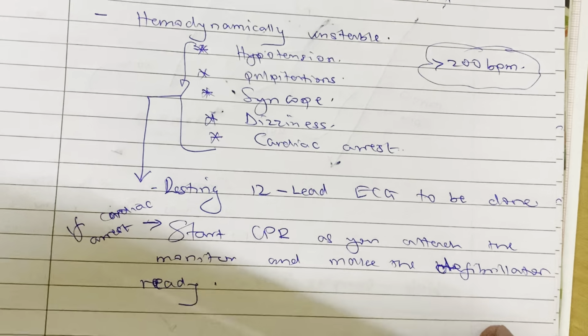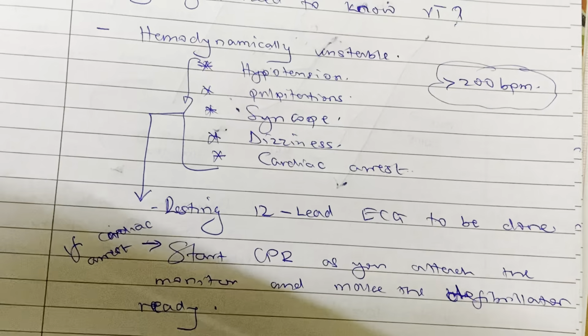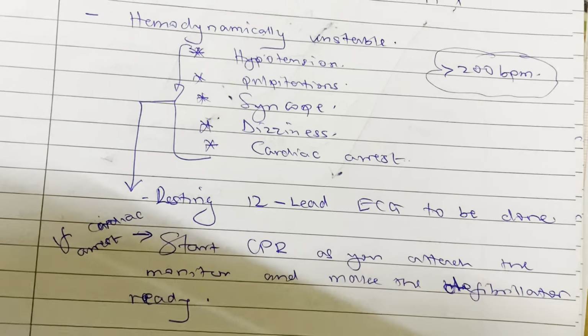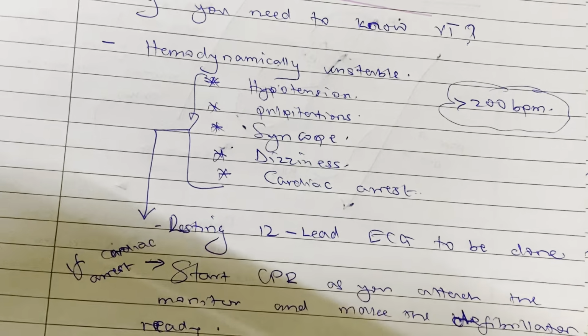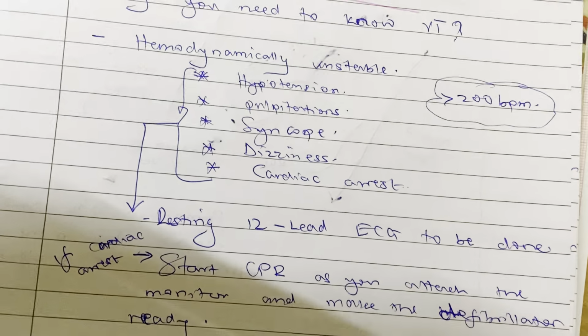We shall see that if the time comes, what a shockable rhythm is and a non-shockable rhythm. But this VT is a shockable rhythm. So you have to attach the monitor, analyze the ECG, and then decide what to do.